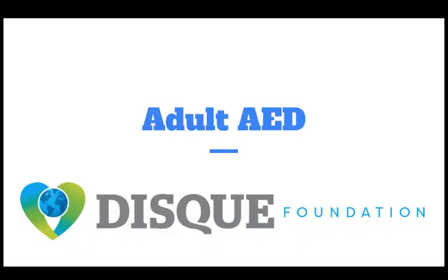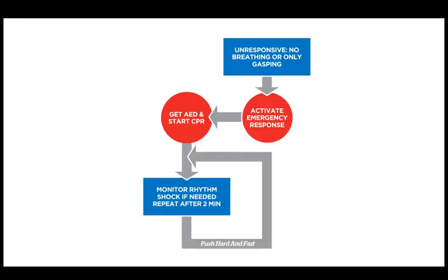Hello everyone and welcome to today's webinar where we will be discussing how to use an AED on an adult. Here again is the BLS algorithm, which we've seen in earlier webinars. Today we are going to be focusing specifically on the defibrillation aspect of BLS.